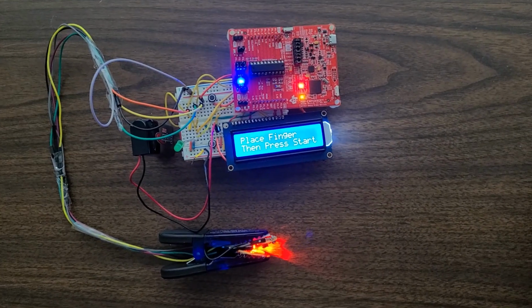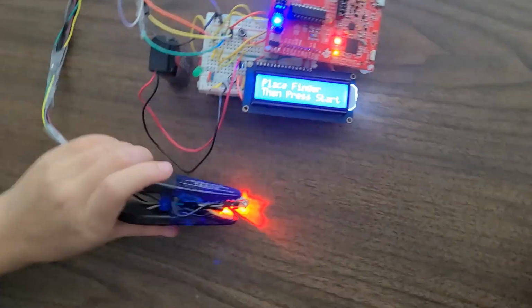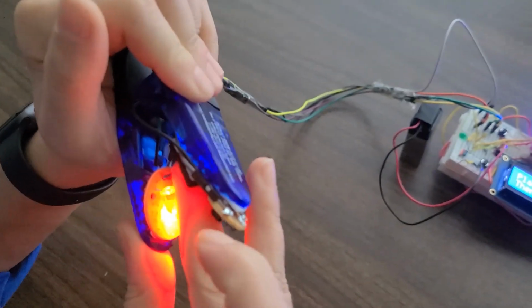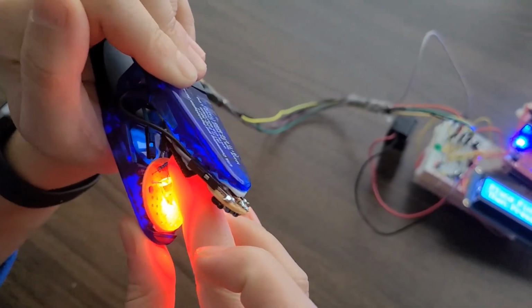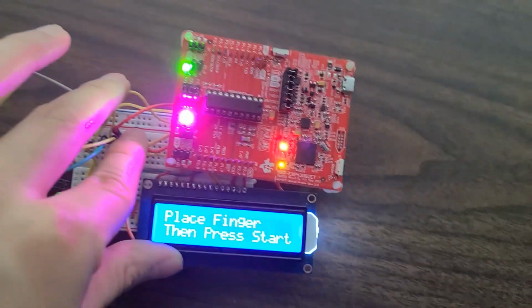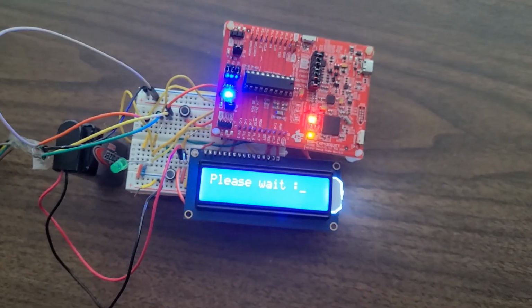Alright, so in order to start the measurement, you need to place your finger exactly in the middle where it aligns between the sensor and the LEDs. Once you have it aligned, you go back to the device and press the start button, which is this switch over here.